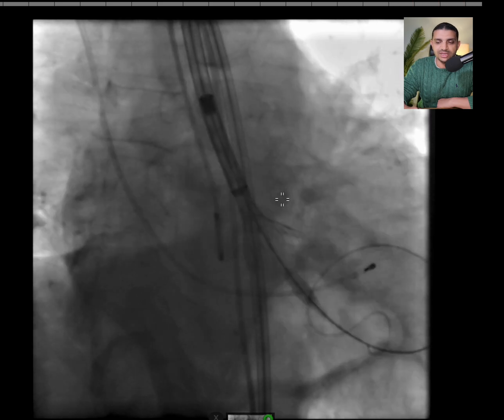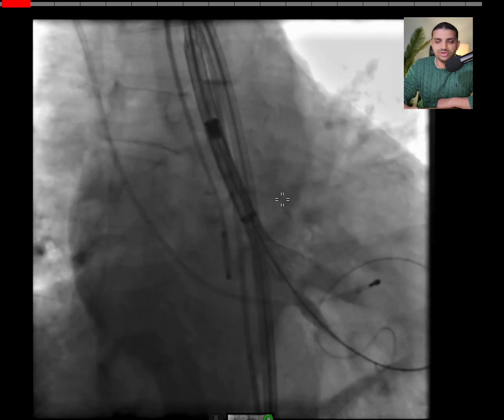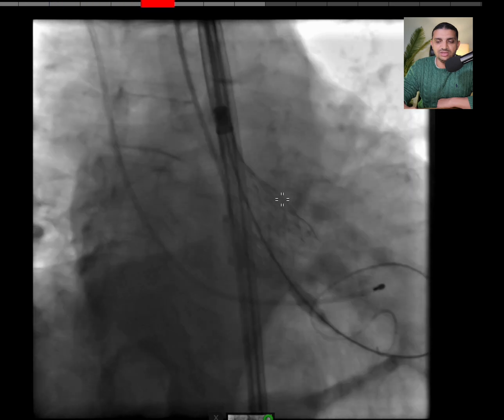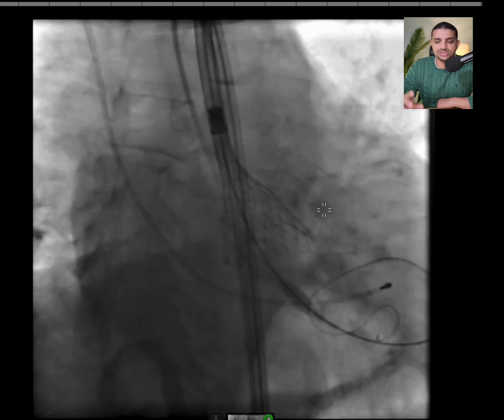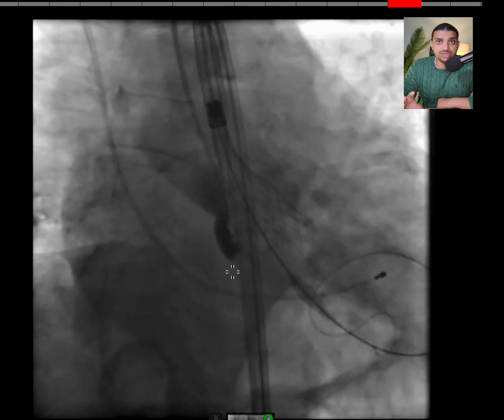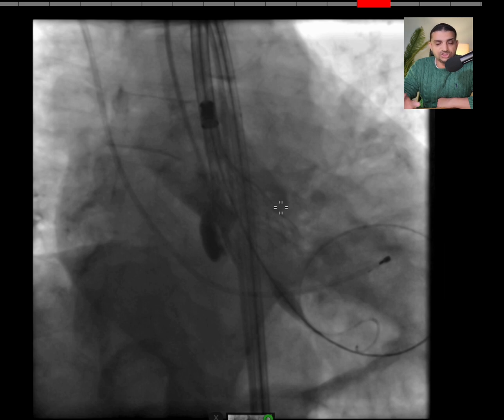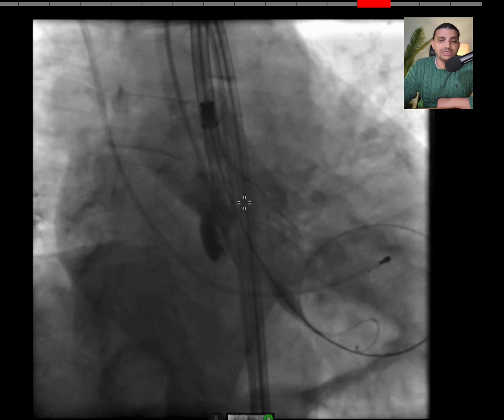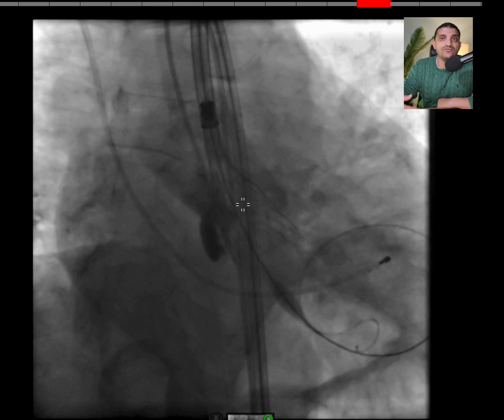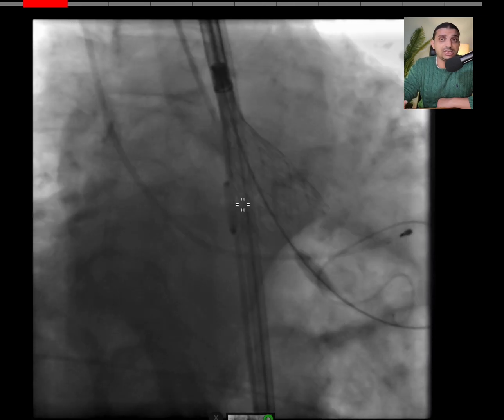I started to deploy my valve and I can see that it is a pretty low valve. I want to pause and discuss something important: at this point, sometimes the hemodynamics drops. This is because the frame of the Medtronic valve is totally obliterating the LVOT and the annular plane. However, the supraannular valve of the Medtronic is not working yet, so you have to go up to at least 80% in order for the supraannular valve to start working. This is where you have to move faster than your regular pace, both at the beginning and at the end.